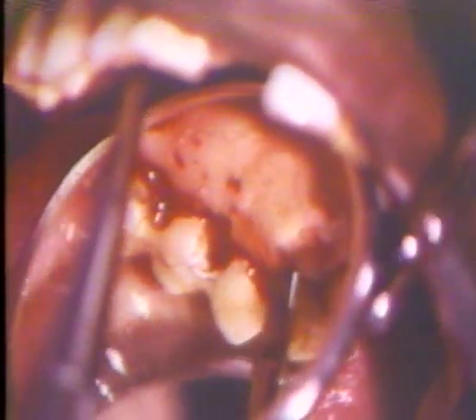The same is repeated on the palatal aspect. If the palatal tissue is too thick to use the razor blade for the internal beveled incision, a scalpel can be substituted to accomplish the same purpose. The internal beveled incision permits the removal of the inner lining of inflammatory tissue, the pocket. Here, following the incision, the palatal internal bevel will be removed.